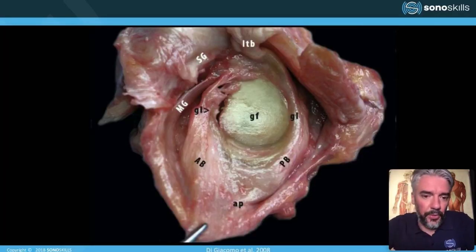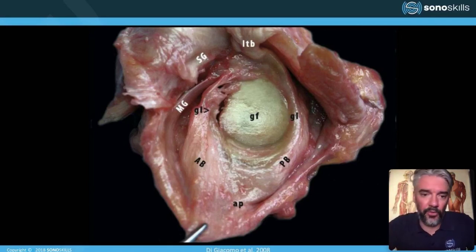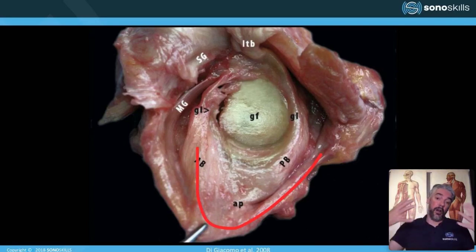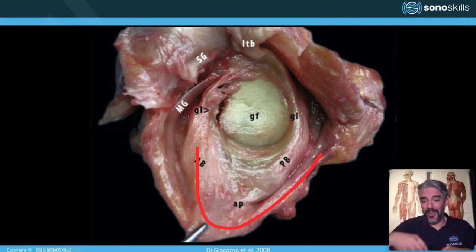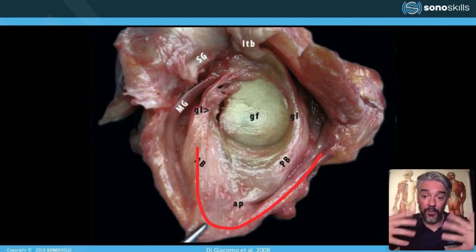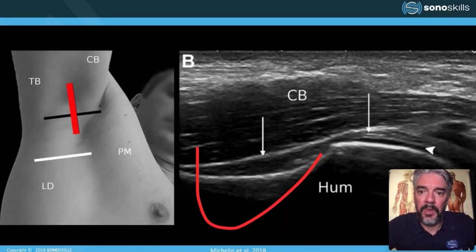And actually, this is also an interesting region. We're going to look at the labrum, the humeral head, but also the axillary recess and the axillary pouch. And this is, in fact, the axillary pouch, a large capsular fold pouch that allows us to lift the arm, making sure that it doesn't stretch too soon and that we can really go up. We have range of motion.